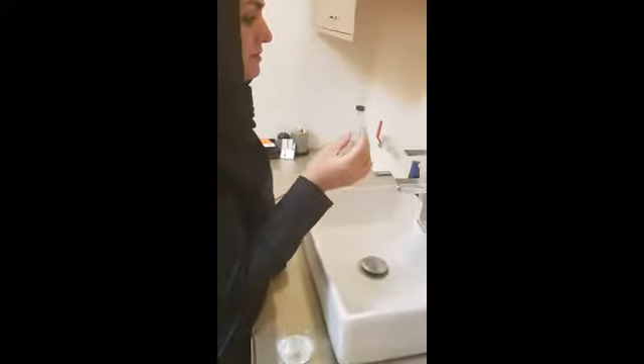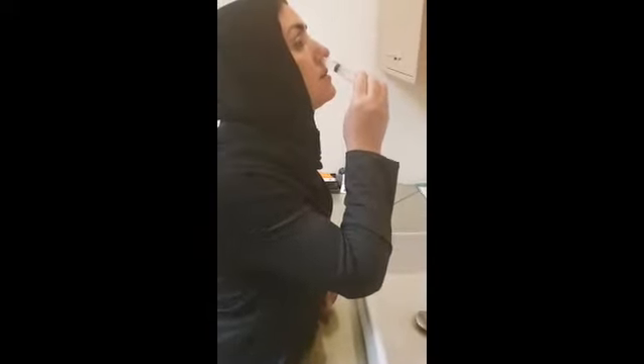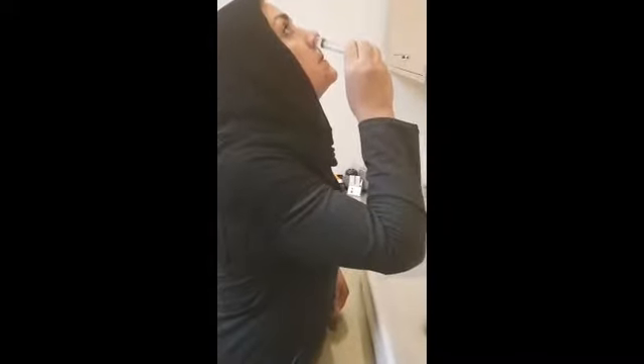You should stand behind the sink and insert the syringe without needle inside your nostril and tilt your head back a little. Then push the syringe so the saline water drops down your nostril and adjust your head forward so the water comes down the nostril. Then repeat for the alternative nostril.